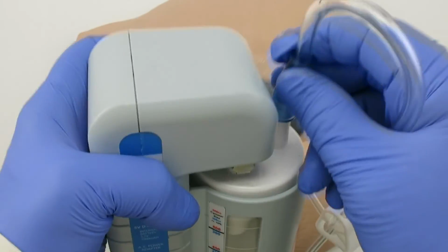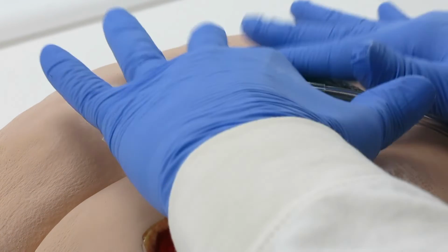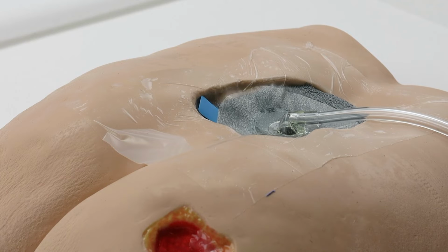Attach the tubing to the canister. Start the device and make sure it is set to the desired pressure and mode. As the dressing pulls to target pressure, mold the speed connect interface, drape, and skin interface. Small leaks will likely seal themselves.